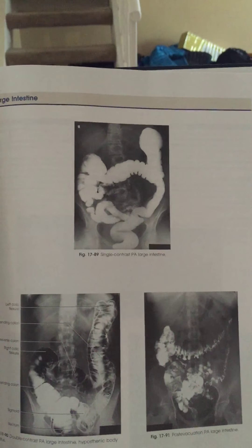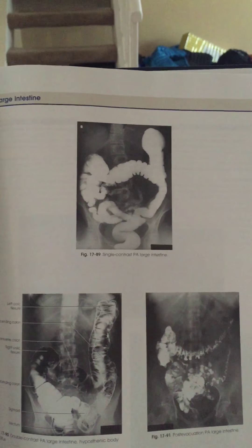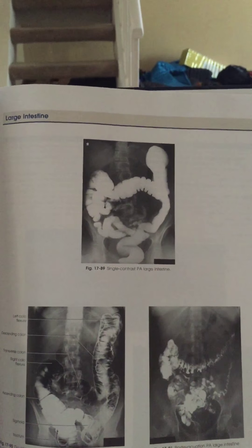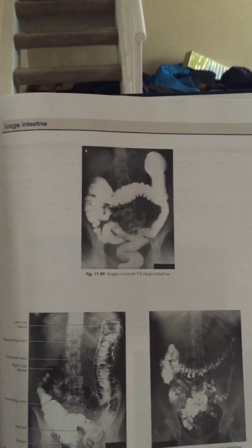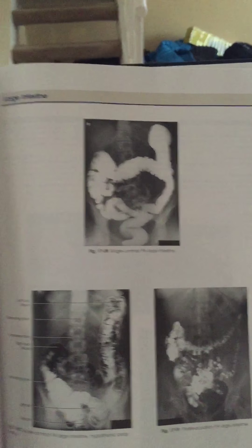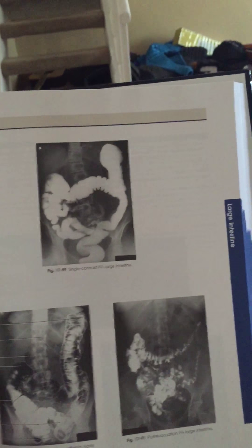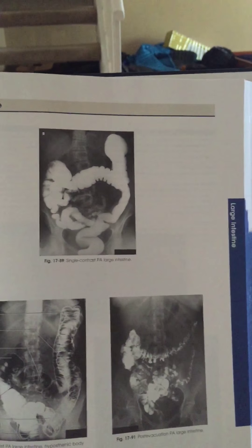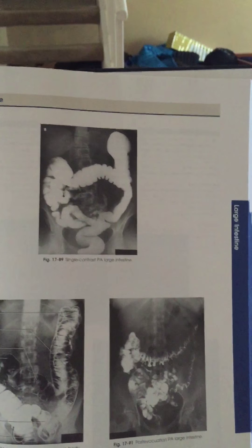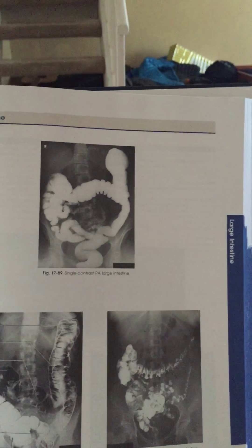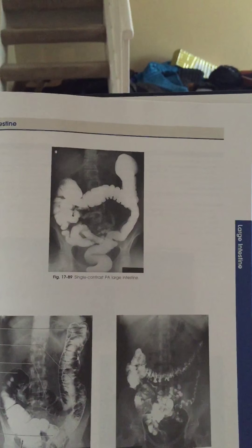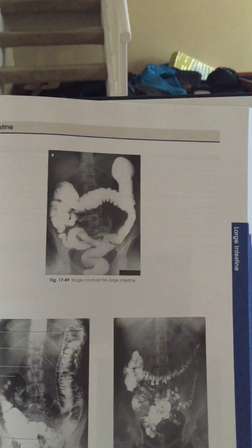The first is my PA Scout, which is going to be a KUB — the first image taken before you give contrast to a patient. You're going to be centering the central ray perpendicular to the IR and entering the midline of the body at the level of the iliac crest.